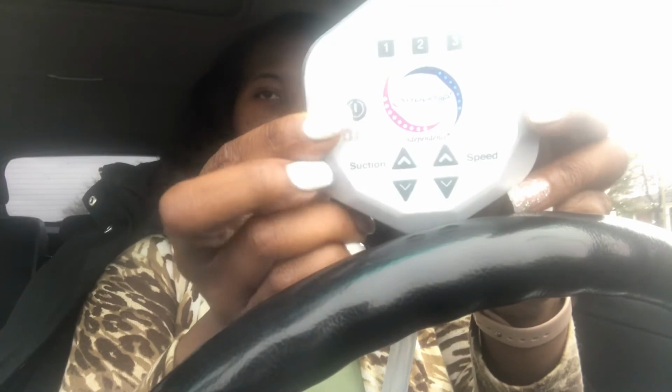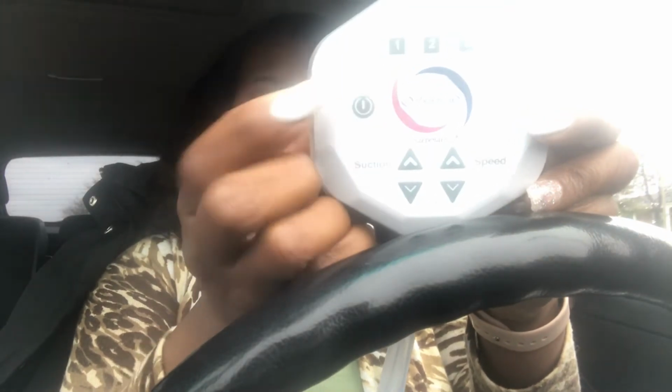And then with this one, I usually let it go until it turns off on its own, but today I don't have that luxury, so I'm stopping at the 20-minute mark. Let's go ahead and press. Ooh, once you see that, I'm gonna go ahead and just press off my power button. Lights go off, pump is off. I'll usually disconnect the tube from the pump.